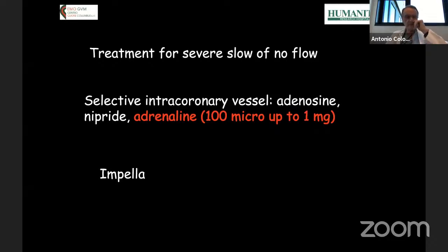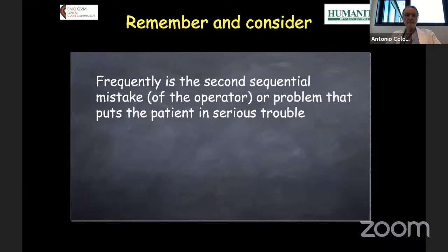And if the patient does not recover, Impella, much better than balloon pump, is the way to go. And remember and consider, this is my last slide, frequently the second sequential mistake of the operator is the problem that put the patient in serious trouble.